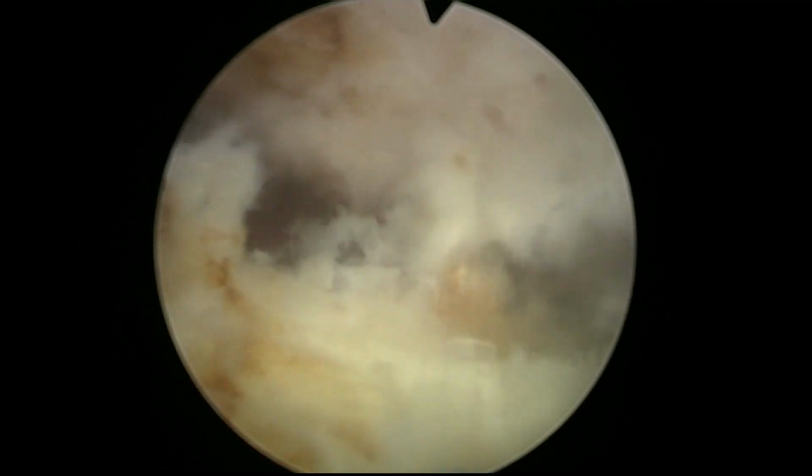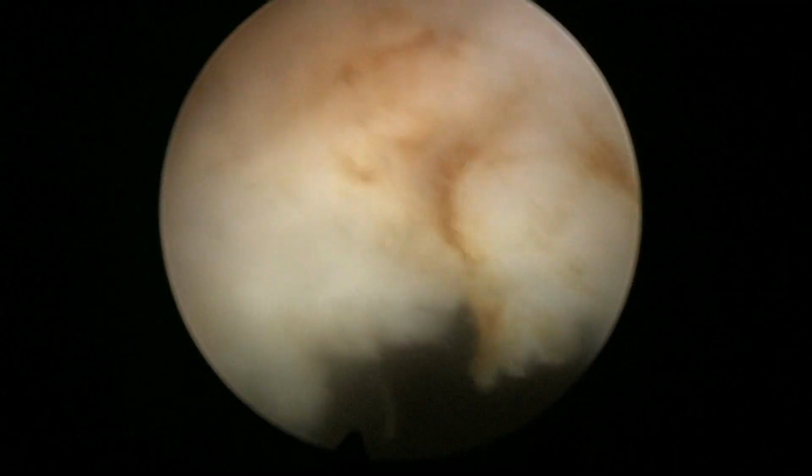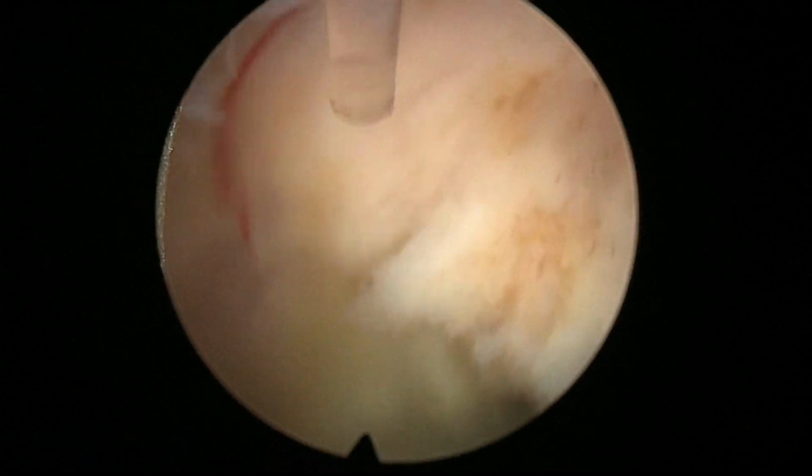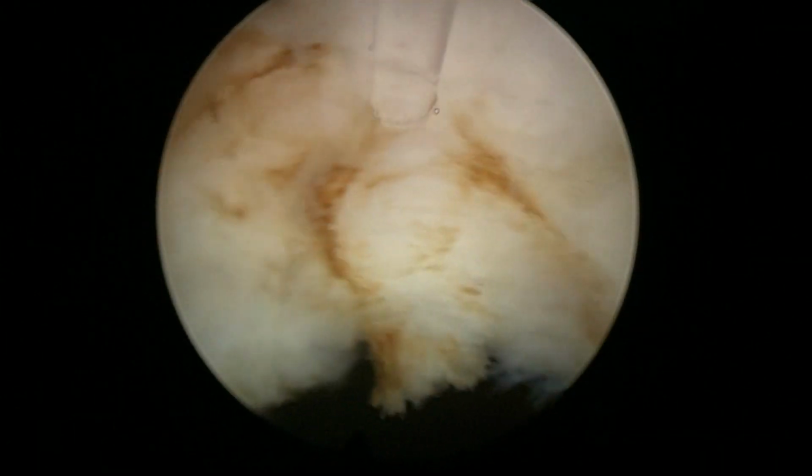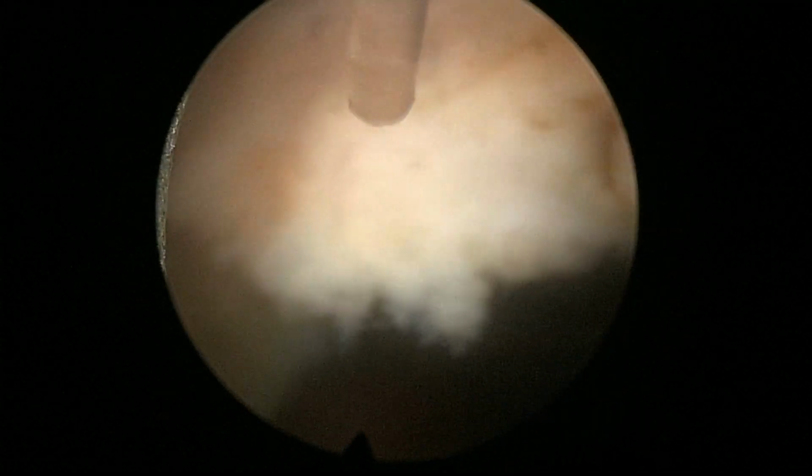So it's been almost 20 years now without doing a proper TURP. But there I went, and that is the fossa. It looks very reasonable. You see, you might be leaving some tissue somewhere, because the planes are not so good.